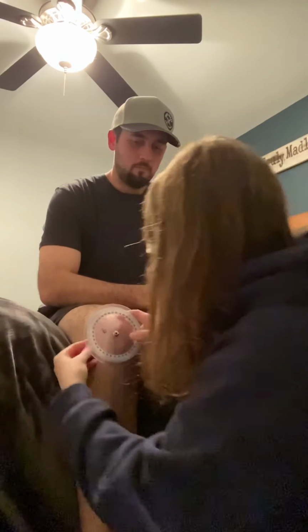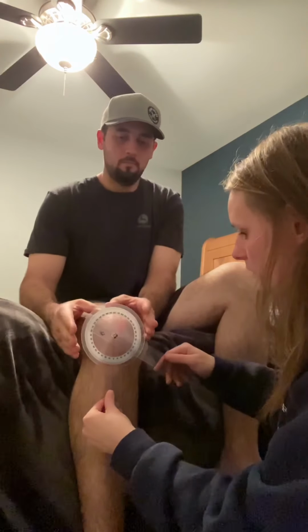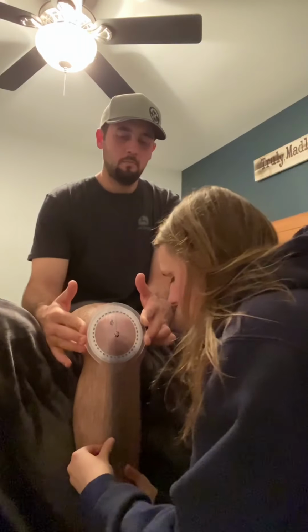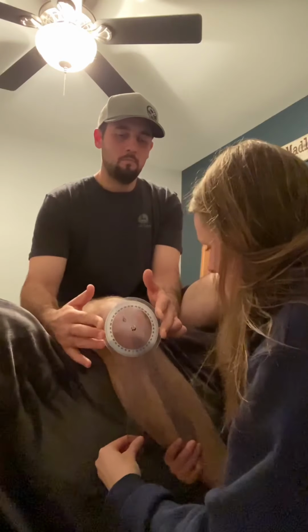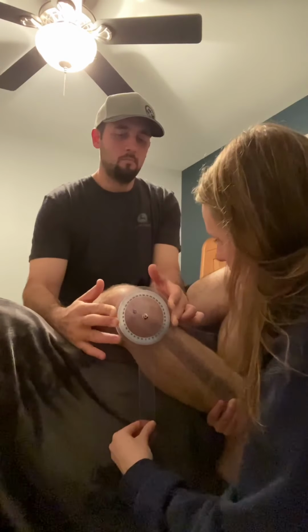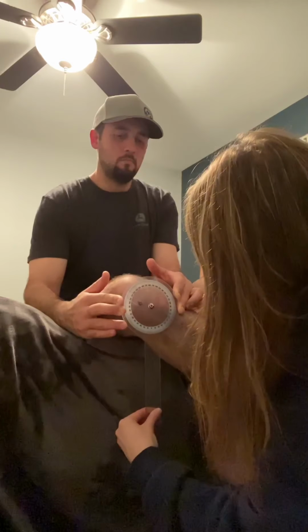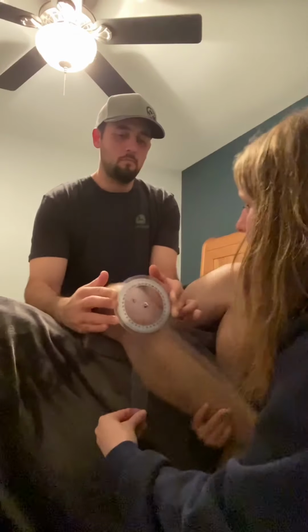So we are going to line up here. Perfect. And I'm just going to have you hold if you don't mind. And then we're going to hold that nice and straight, and we are going to move that leg into external rotation. You are at 45 degrees there. Beautiful. And we're going to do the same thing for hip internal rotation from here.